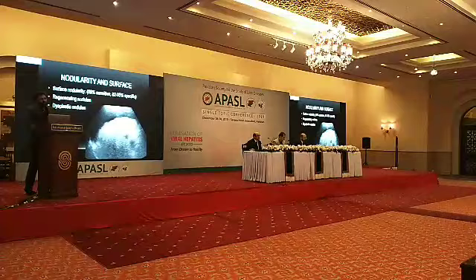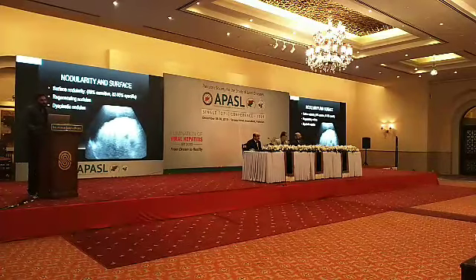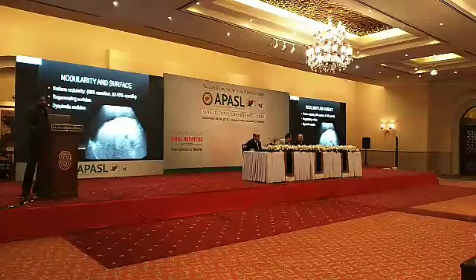It's easy to see, as in this image, when the patient has ascites, but when the patient does not have ascites, it is not usually commented well upon. And those are the patients whom you suspect of portal cirrhosis, and you want that information from. So surface nodularity is very specific and very sensitive as well.